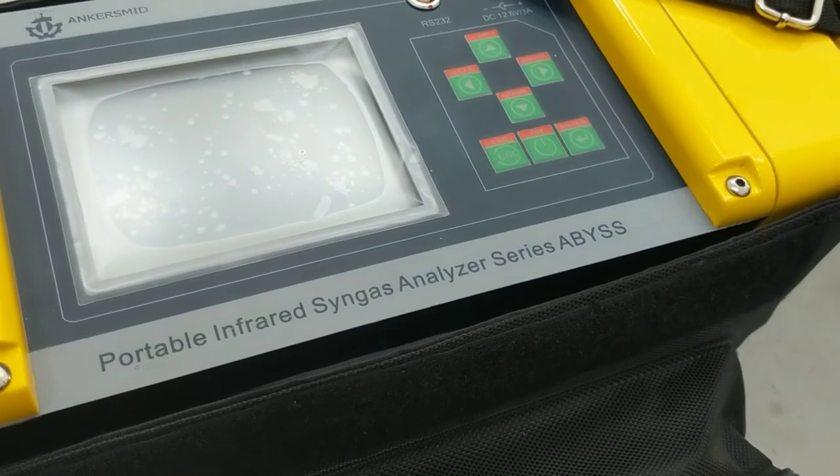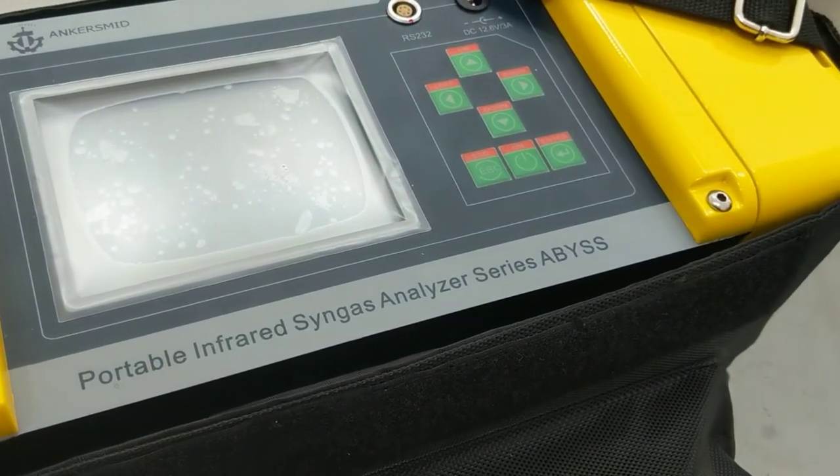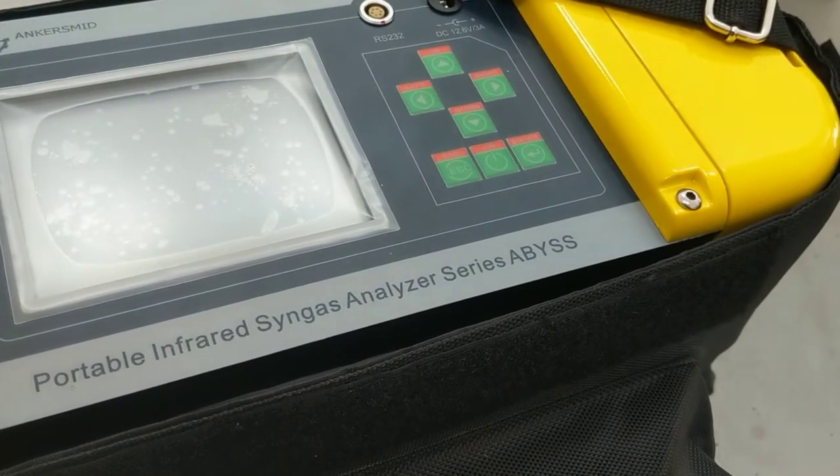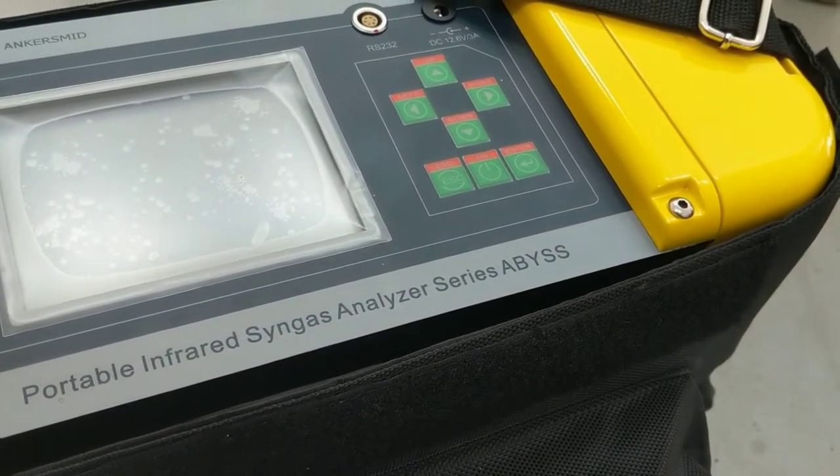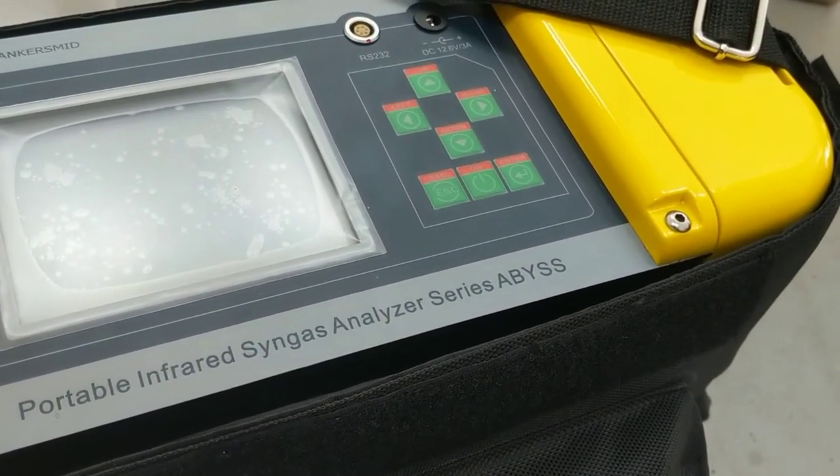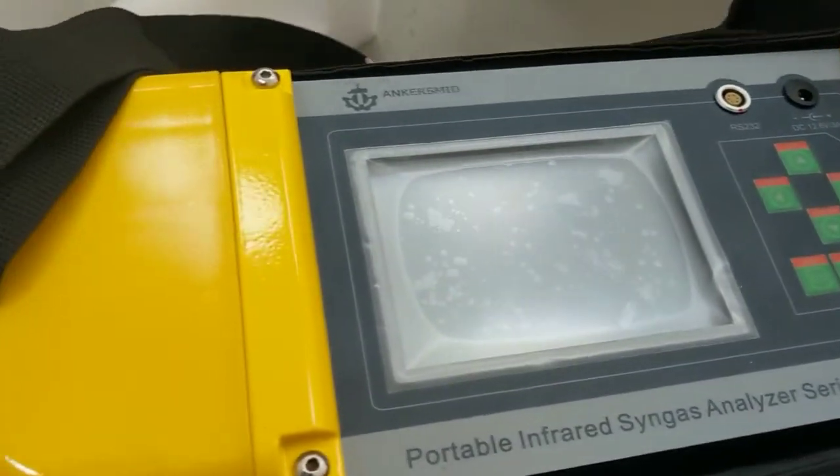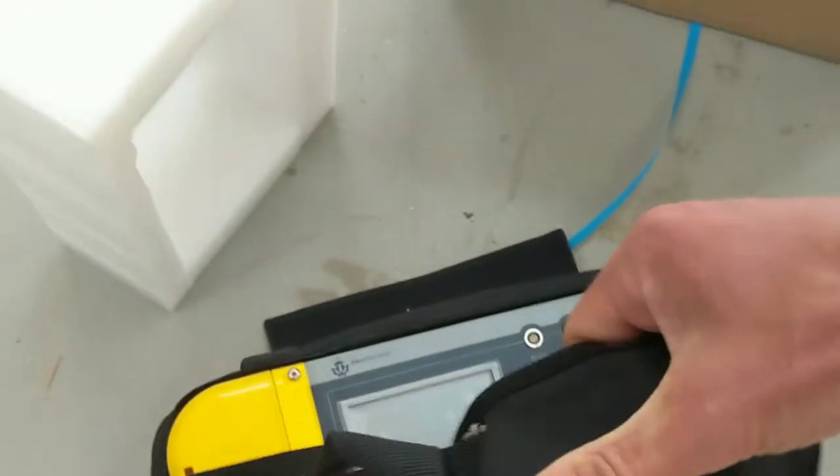Portable infrared syngas analyzer abyss. Ooh, look at that shoulder strap.